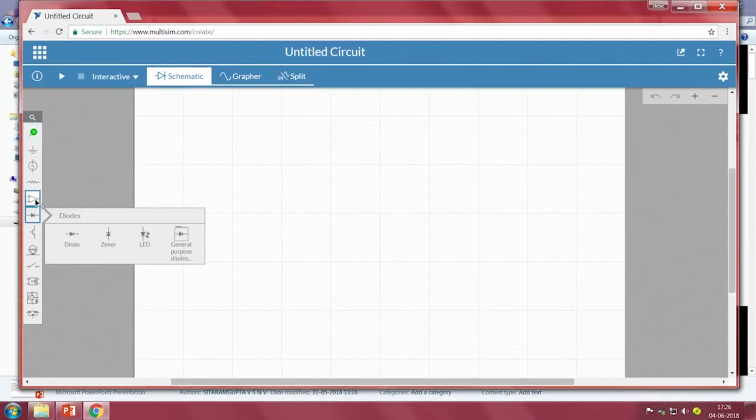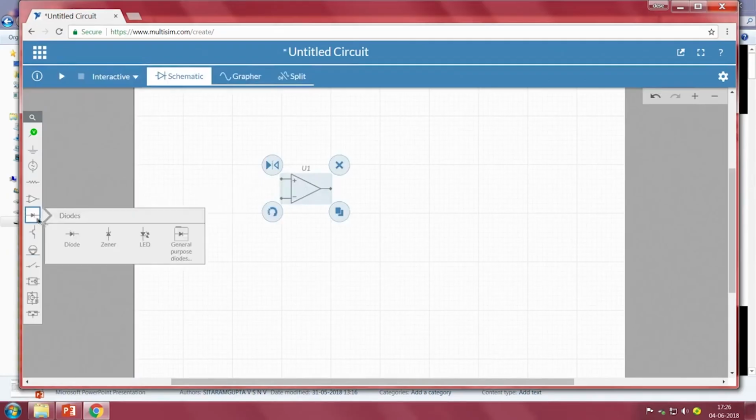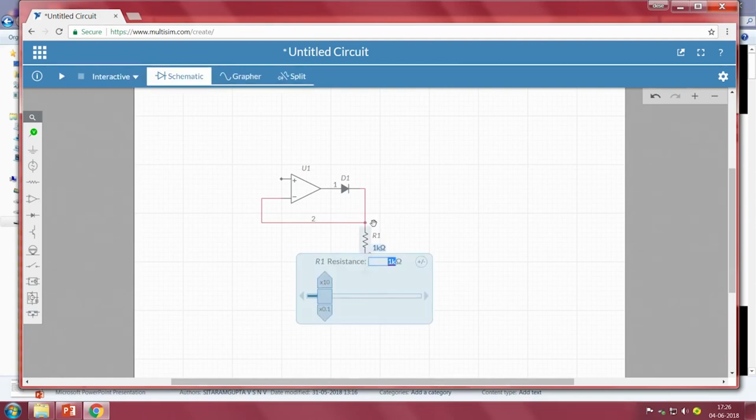We require a diode. Let me take an op amp as well as a diode. Then we require a resistor. So, the negative terminal should be connected here, and this is RL. Any resistance value is more than enough at this point. We can even go with 10K, it will not load the input. So, let me take it as a 10K resistor.